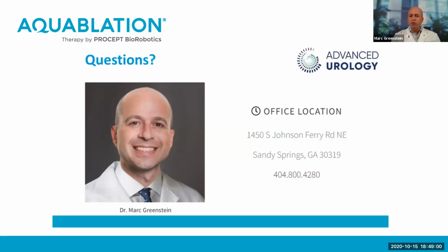There is an old school side effect called a TUR syndrome, or transurethral syndrome. In other words, when I scrape the prostate, I am causing veins to open in the prostate. And when I scrape the prostate and do prostate surgery, I'm using irrigation to see where I'm going. That irrigation can get into the venous system. If that irrigation gets into the venous system too long or too much, a person's salt levels will drop. If their salt levels drop, they can get very sick.